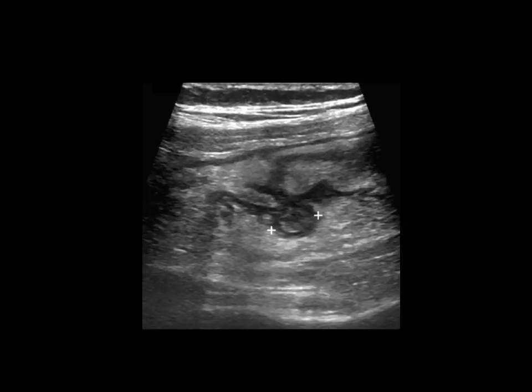Here's a nice example. This is a still image of a diverticula. And you can see it up here, we've got our colon and then this little outpouching. These almost look like grape-like structures coming off of the bowel. And here you can see some fat stranding, some bright white hyperechoic fat surrounding that diverticulum. And when we pressed down, this patient was tender in this area, leading us to diagnose diverticulitis.